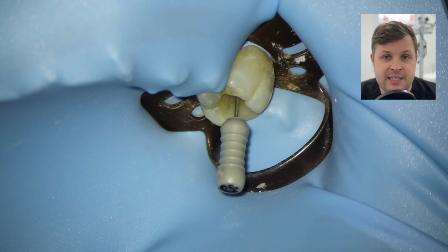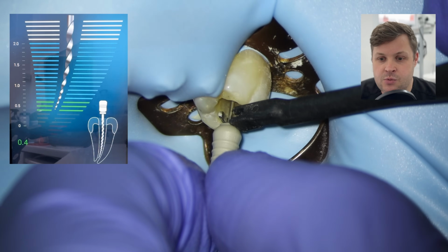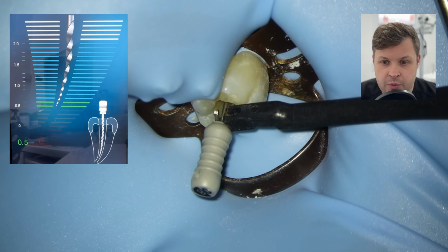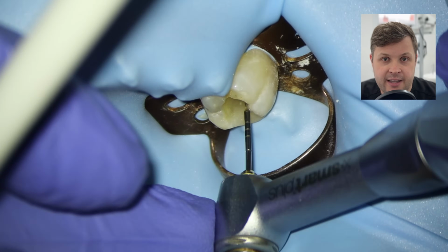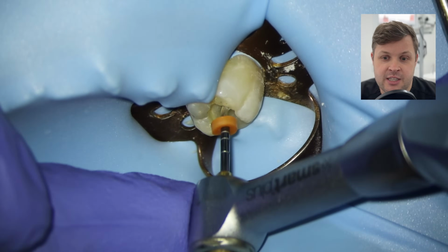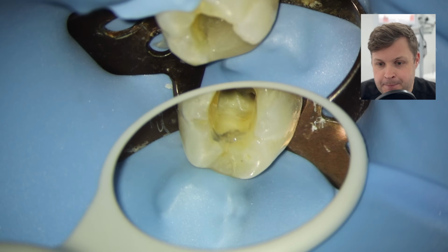The best thing to do in this case is just hook it up to the apex locator, just get a provisional reading. And as we hook the D-finder up here, we can see that we're a little bit too far off 0. So again, I don't want to push too far. I'm going to bring out that D-finder, and I'm going to shape the coronal third with the glide path file of 15/03, and then obviously the 25 variable taper, just to open up that canal space.